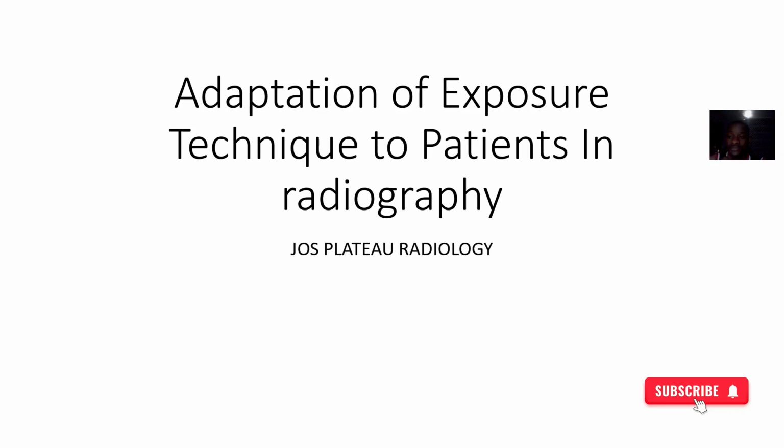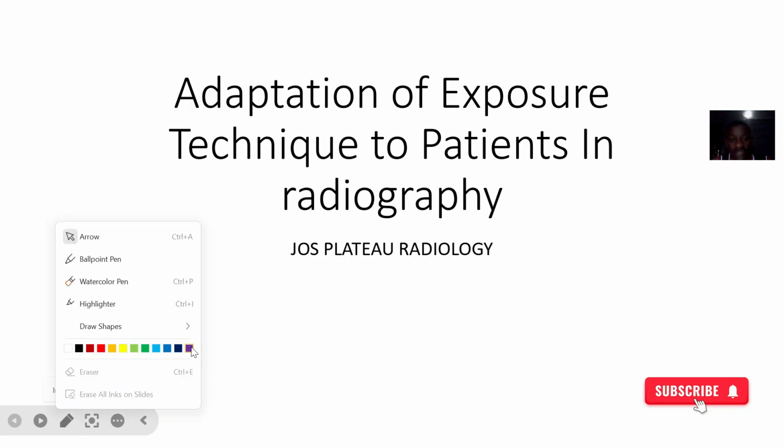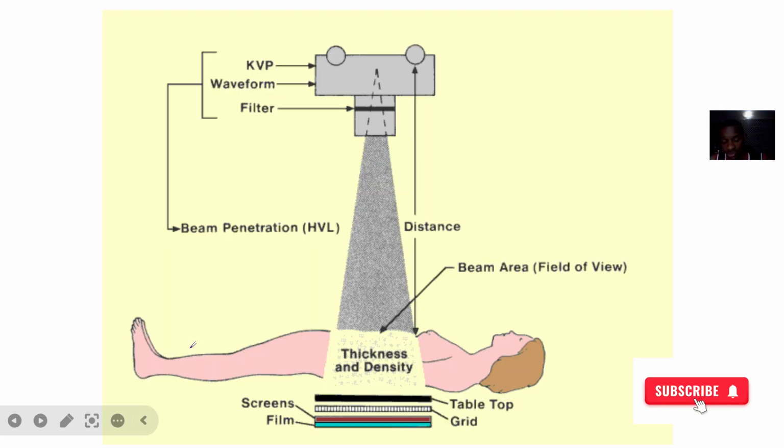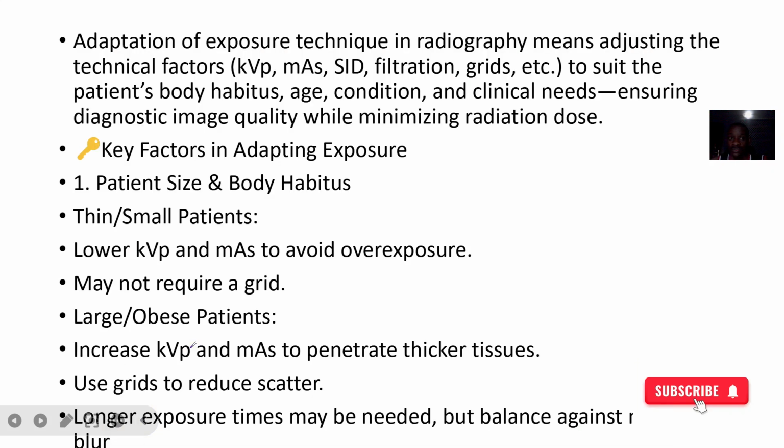Okay, now we'll look at another scenario in radiography, and this is where you're talking about adaptation of exposure techniques to patients in radiography. So around this particular area, what are the things that we look forward to? What are the things we look to achieve? So exposure has to do with radiation energy, right? Exposure to radiation energy. So adaptation of exposure technique in radiography just simply means what?